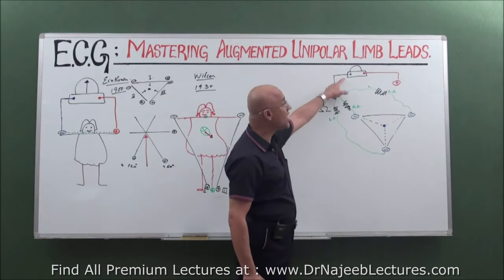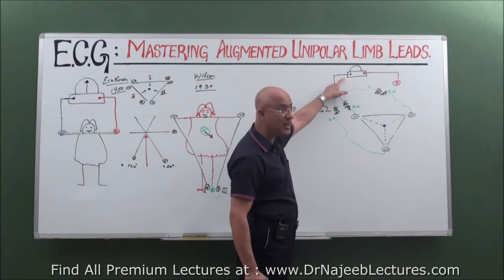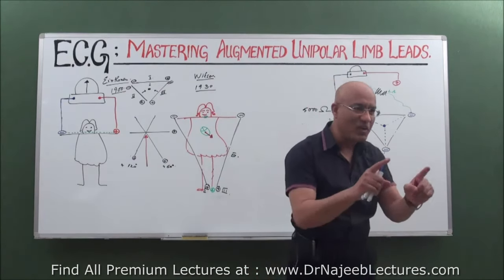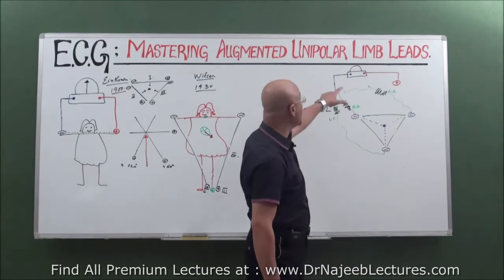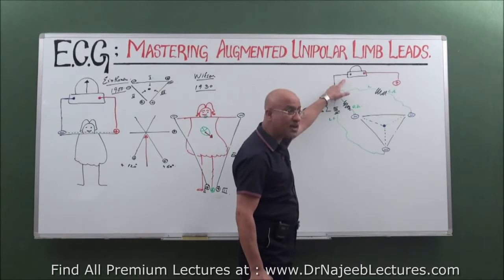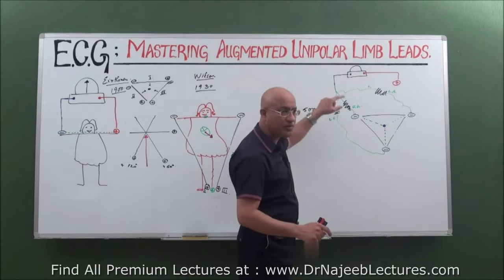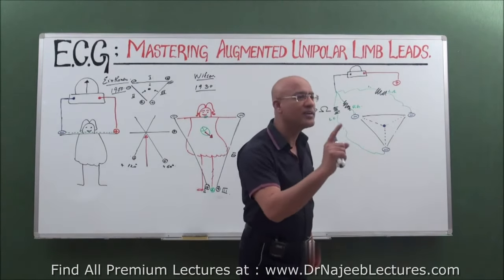This is how we made this indifferent electrode: the negative electrode put at three different corners of an almost equilateral triangle, assuming the heart in the center, and adding resistance there. So we converted the negative terminal of the machine, or galvanometer, or electrocardiograph, into a common indifferent terminal, because it is taking all three pieces of information.